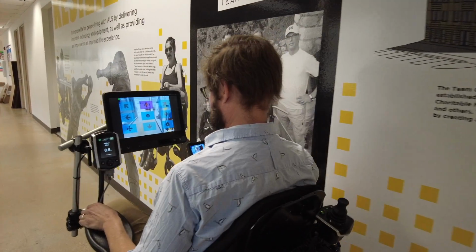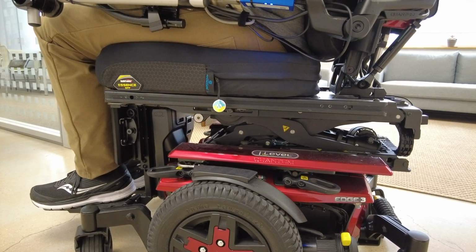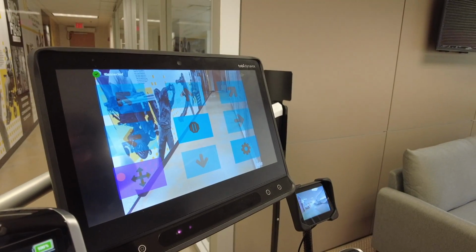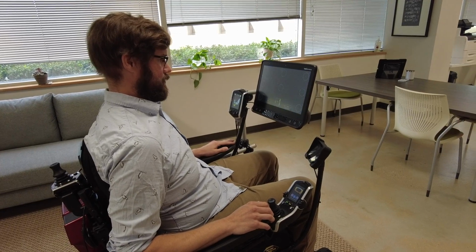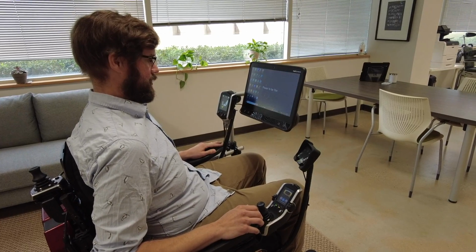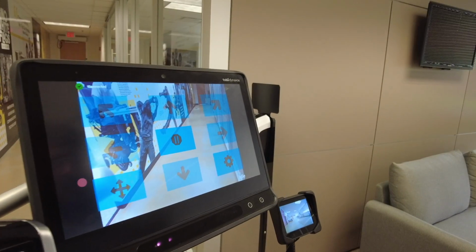How to use Ability Drive? With a little practice, you can master driving and adjusting seating on your power wheelchair with just your eyes. Let's get started. If needed, calibrate your eye gaze system. See the documentation of the eye gaze device you are using to determine how to calibrate. Launch the Ability Drive application on the eye gaze device.